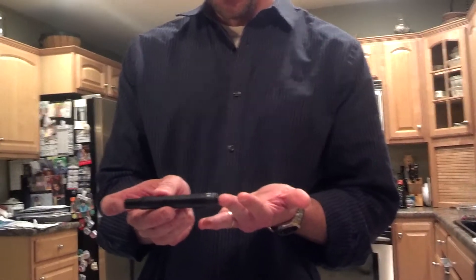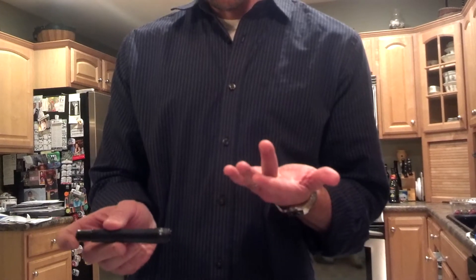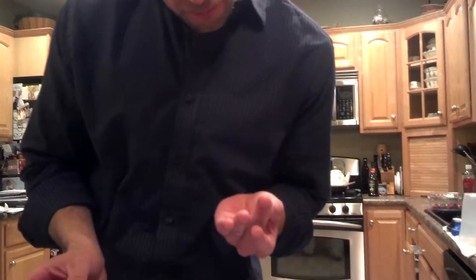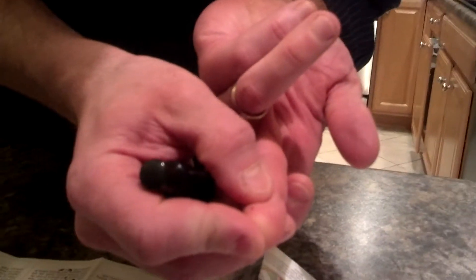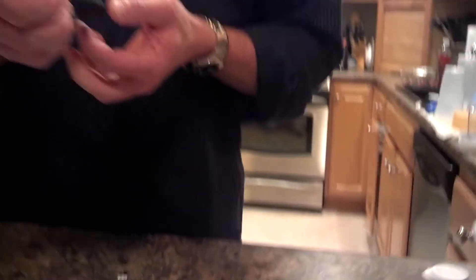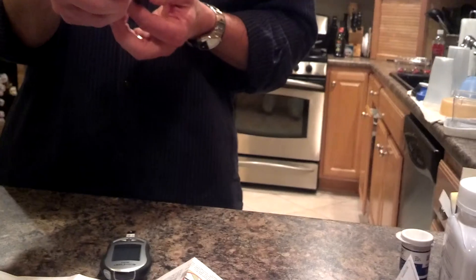That didn't really hurt. Here comes a bit of blood. I'm not sure that's going to be enough though. That means I need to make it go deeper. I got enough out of there now.